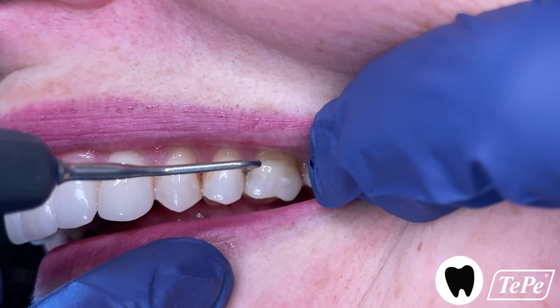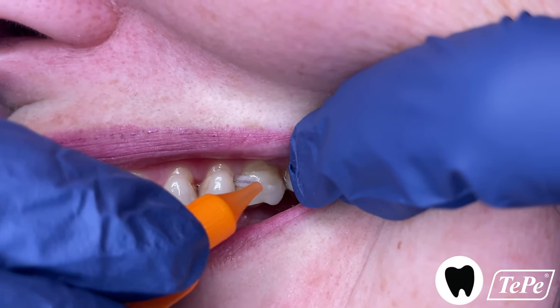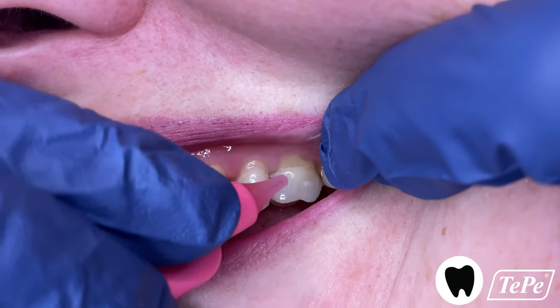You'll want a snug but not tight fit between the teeth. As you can see, this size is too large for the space. You shouldn't have to force it through, and the plastic coated wire shouldn't touch the sides of the teeth, so downsize for this area.